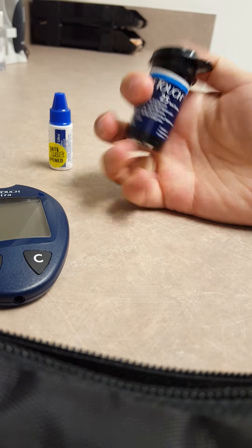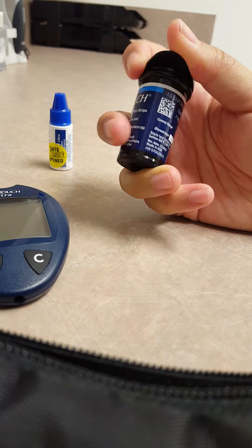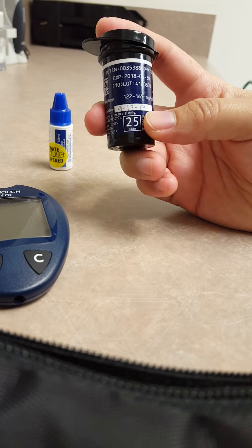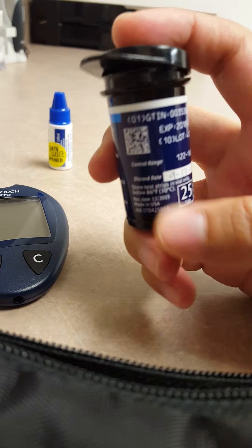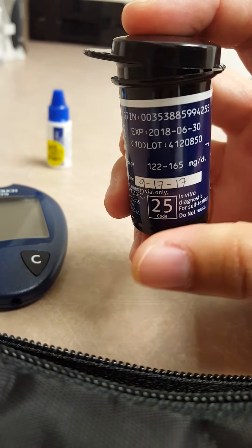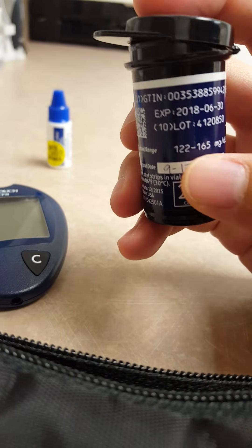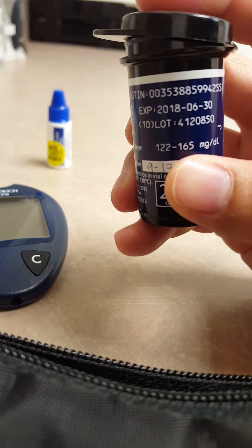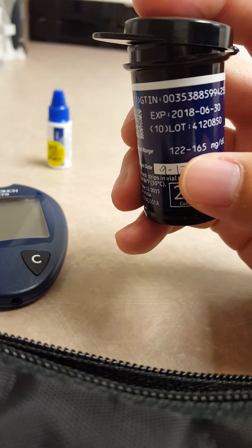And then you're going to want your test strips. With your test strips you should have the expiration date written on there, and it will have the control range of what your results should be. As you can see, this one is going to expire September 17th. Our control range is going to be 122 to 165 — that's the result you're going to want to expect.